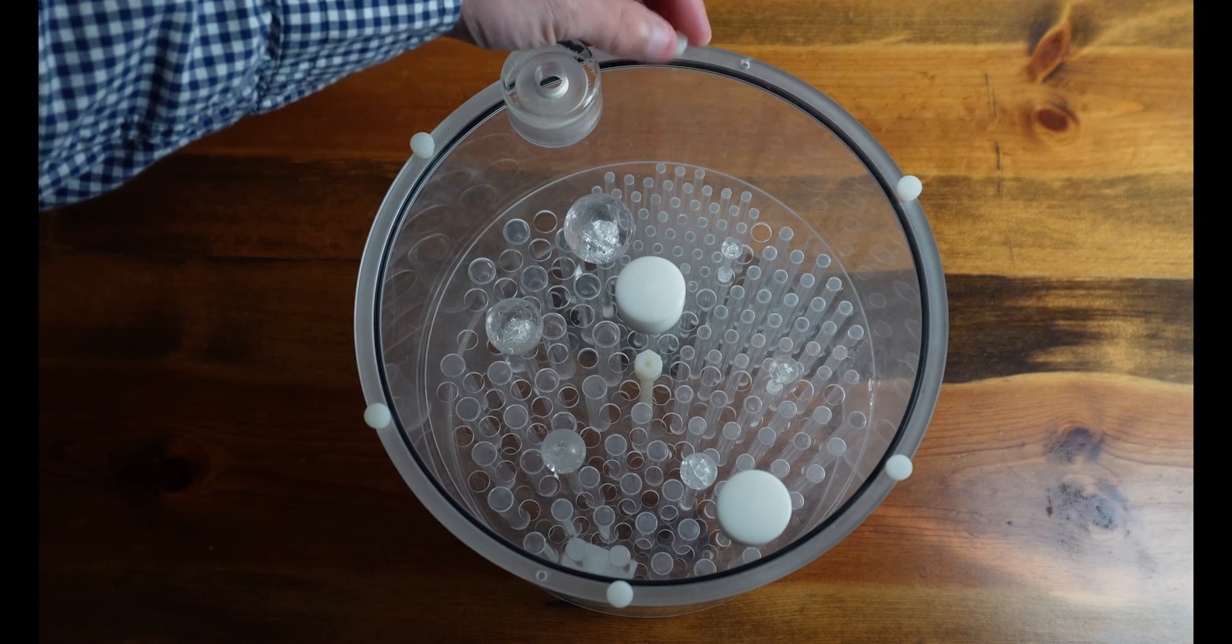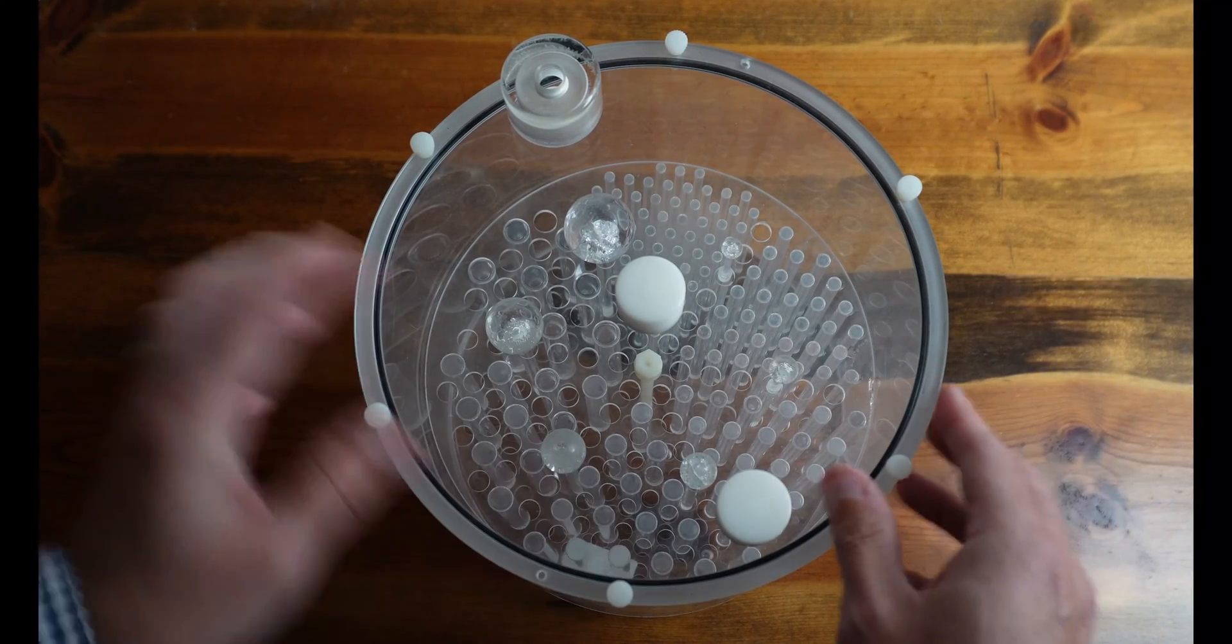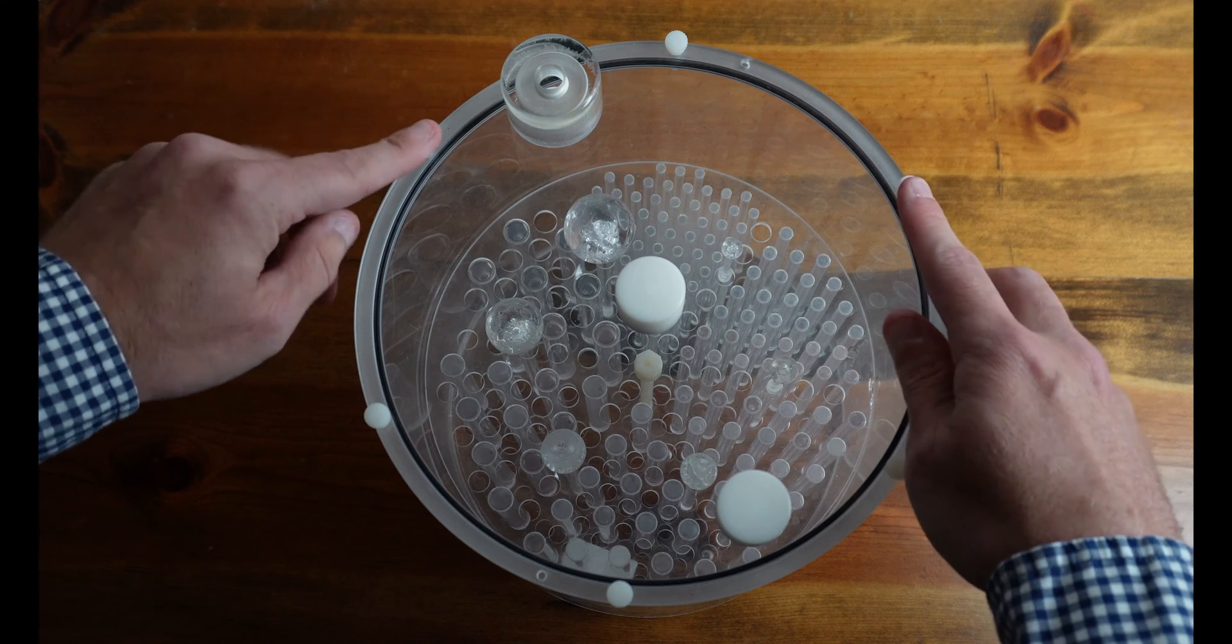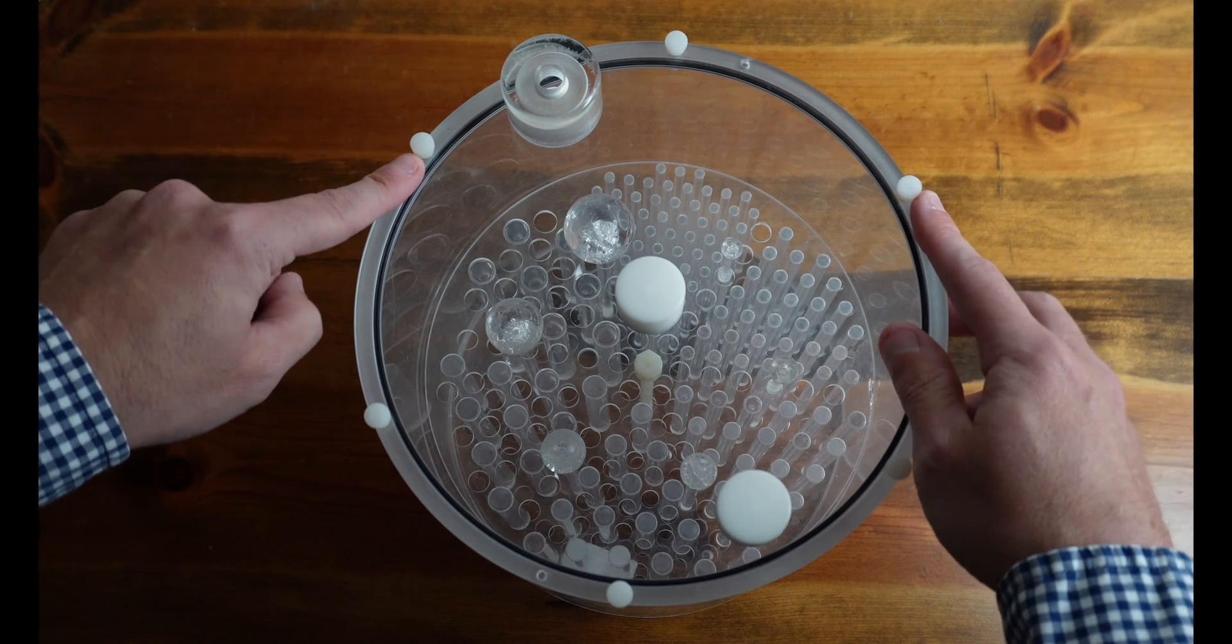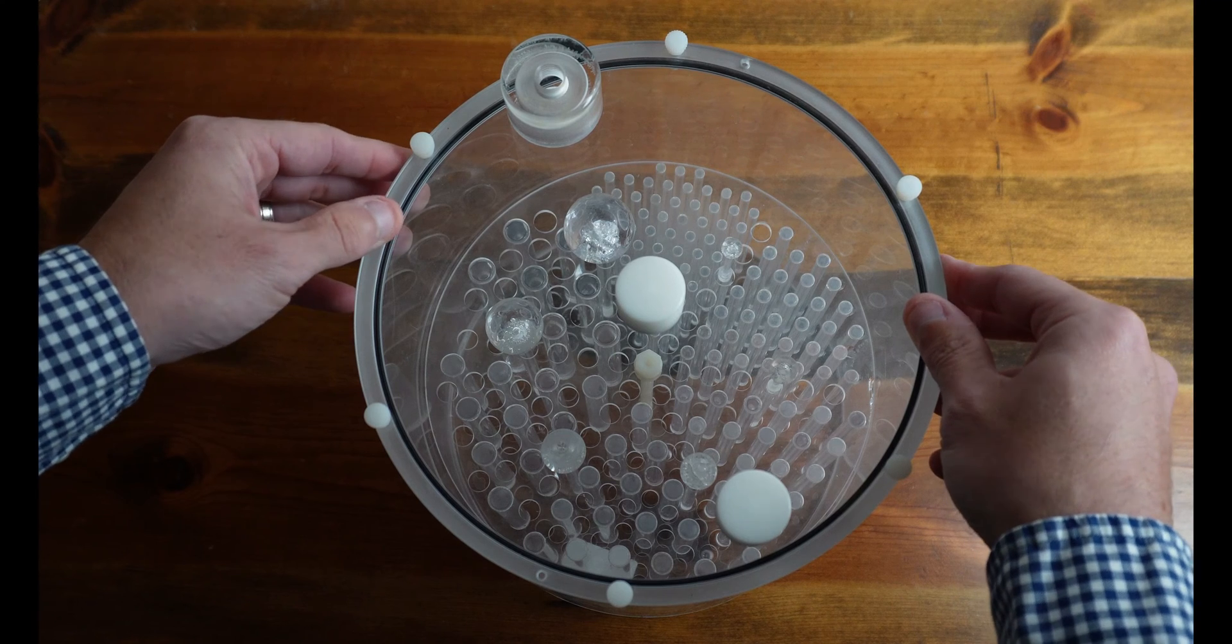Tightening up the last screw here. So we want to make sure that the lid is seated well. We don't want to over-tighten the nylon screws because we could snap them. We don't want to do that. But we do want it to be a nice, snug fit.